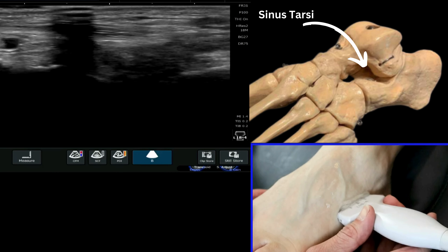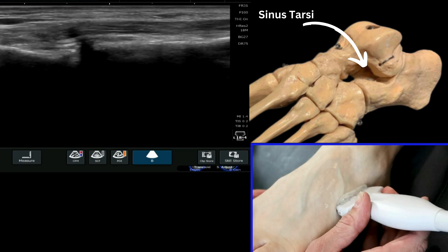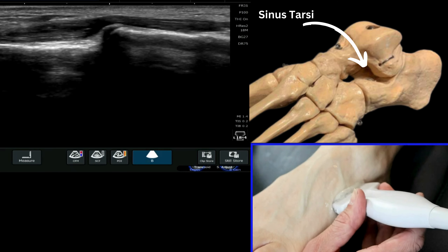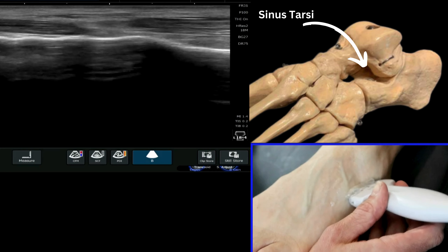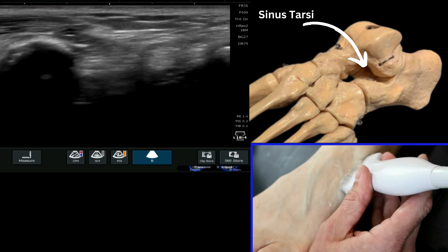What I'm going to suggest you do to start with is pop your probe on the lateral aspect of the foot and identify the calcaneo-cuboid joint. We can see that here, and we can see that this is the calcaneus here and this is the anterior process of the calcaneus. If we then move our probe slightly more proximal and angle up, keeping that calcaneus in view on the left of the image.